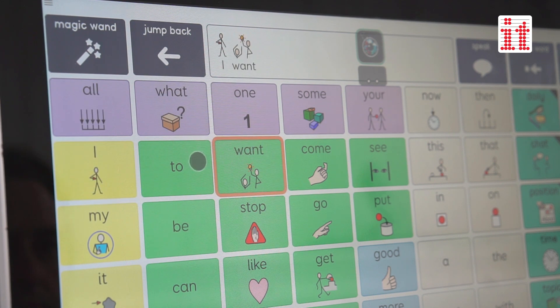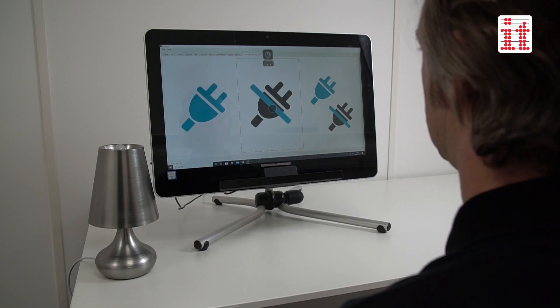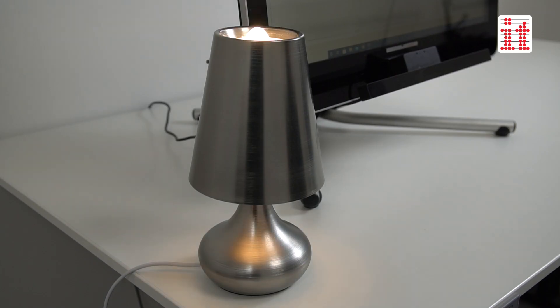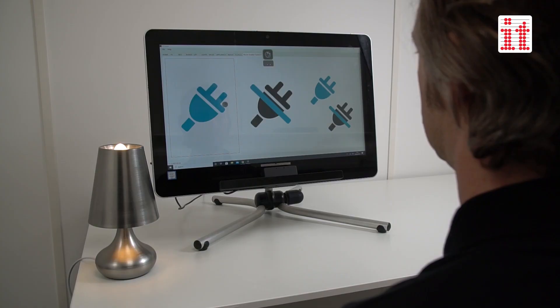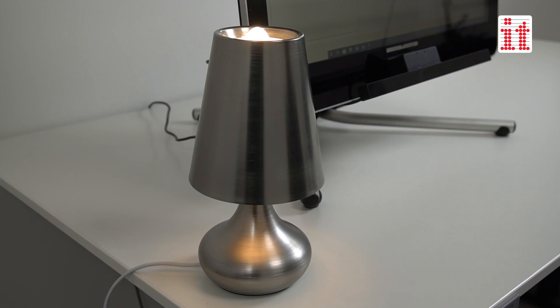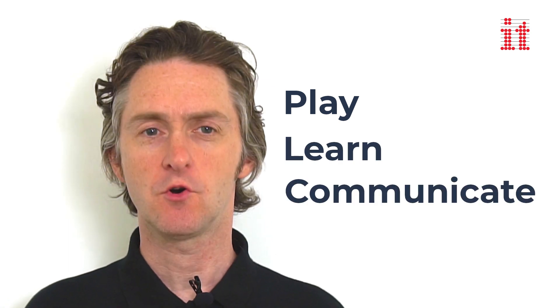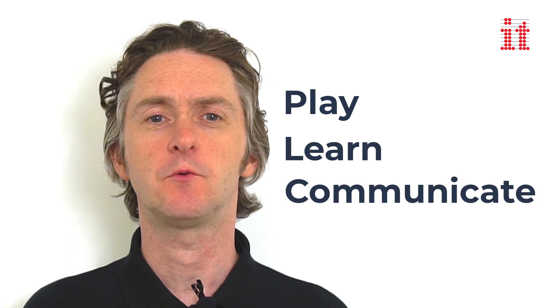You can also use Skyl for Windows for environmental control purposes — operate simple mains powered on-off devices such as a lamp or a fan, or access devices that are operated by remote control such as televisions and music systems. Play, learn, communicate and more with Skyl for Windows, the first choice for eye tracking in the classroom and beyond.